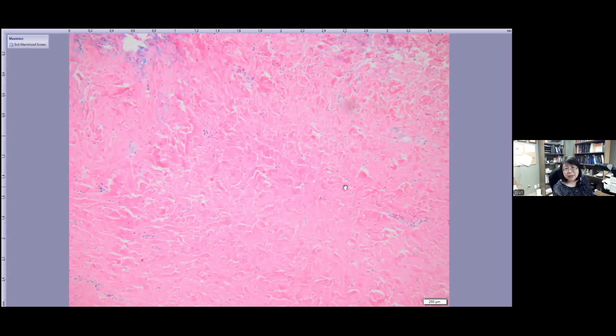But in children, you definitely want to rule out Gardner fibroma because it may be the first presentation of an APC gene germline mutation. So they need a gene test to monitor for colon cancer or something like that. Sometimes this is a sentinel sign for Gardner syndrome. So it is very important to recognize. At least you need to rule it out.